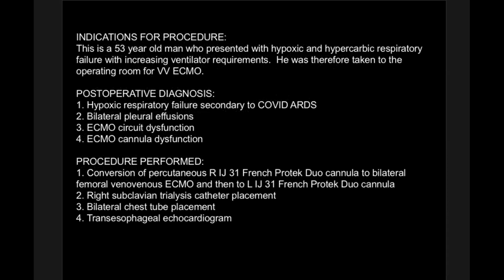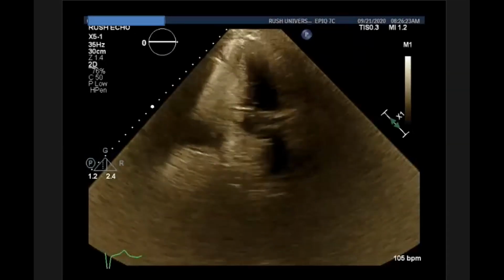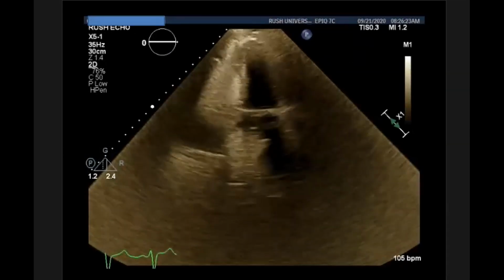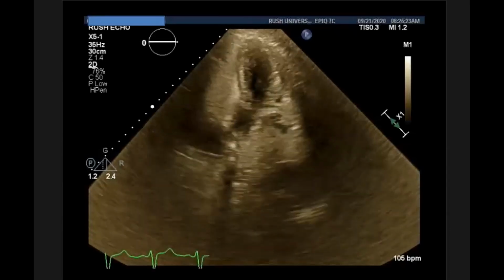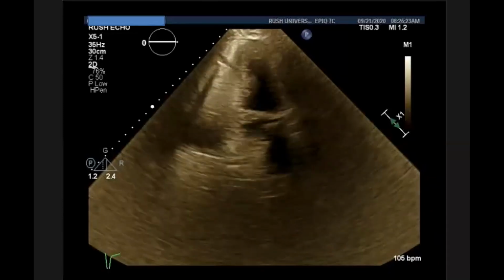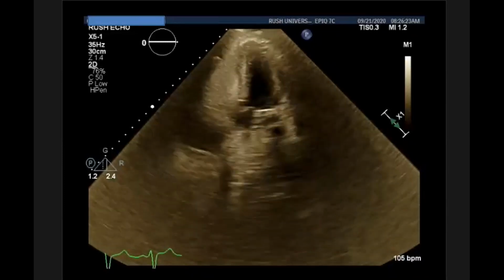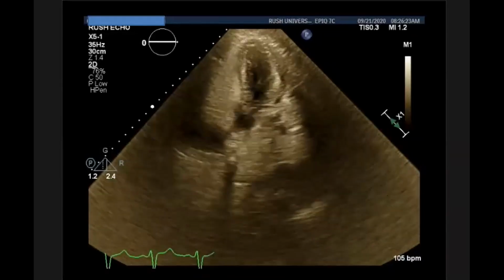And the final case that I want to show is actually an ECMO case. This was an unfortunate 53-year-old gentleman who developed COVID and developed terrible hypoxia and hypercapnic respiratory failure. And we were asked to evaluate his transthoracic echo. And as you can see, the RA and RV are just filled with, is this blood? This was not with contrast. This is a transthoracic apical 4-chamber view without contrast.